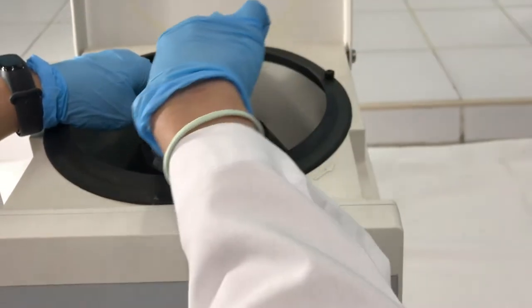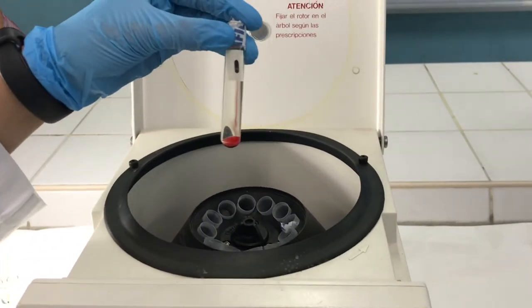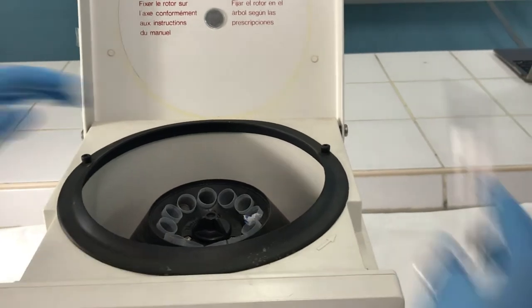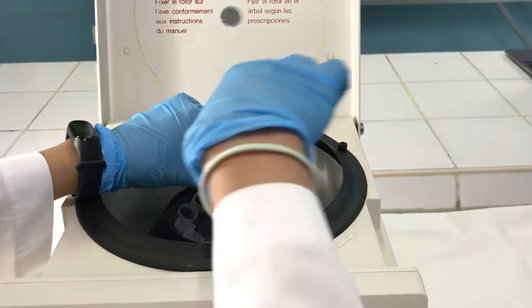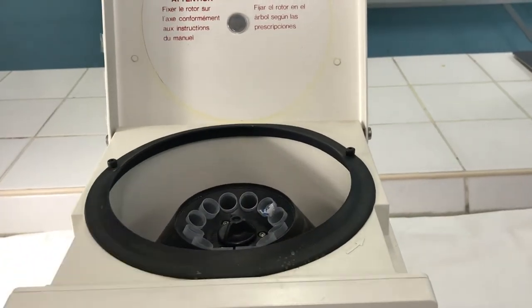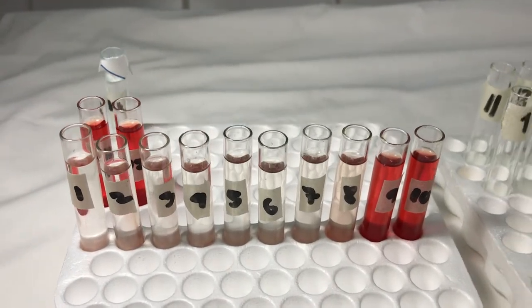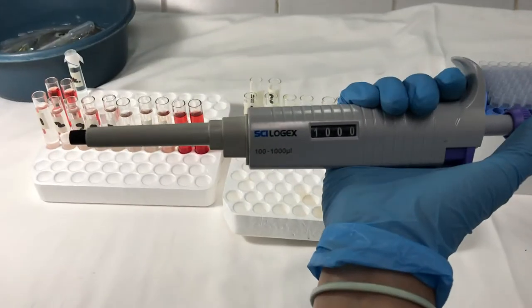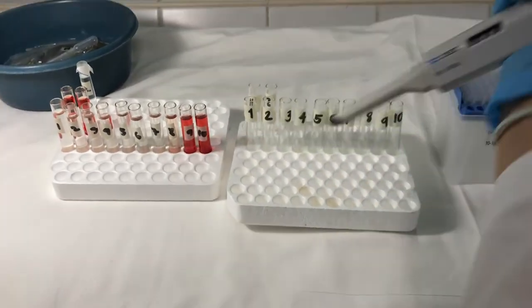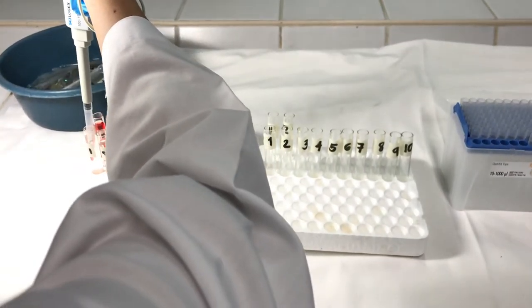After, carefully take out the tubes from the centrifuge. Make sure not to dislodge any sediment found on the bottom of the tubes. You should be able to see a varying gradient of hemolysis in your tubes. Next, transfer the supernatant of each tube into new labelled tubes.